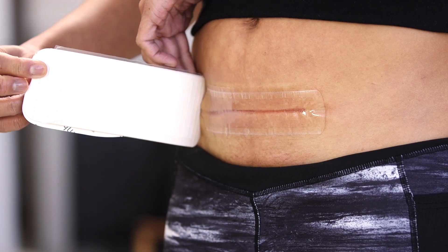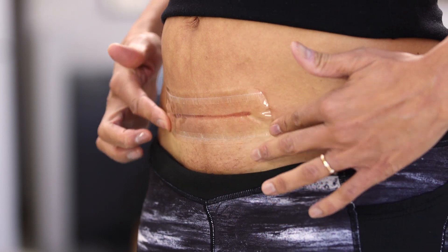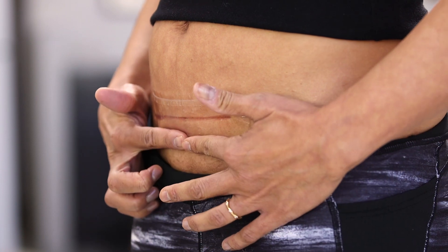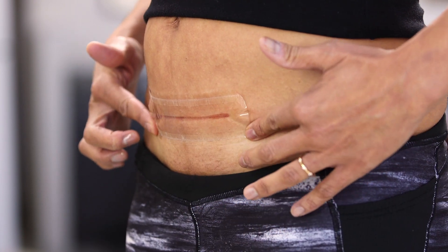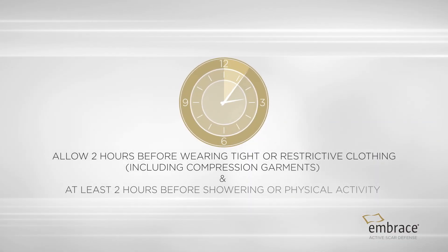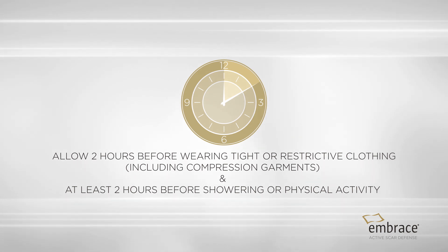If any air pockets occur, smooth them out and make sure the dressing is evenly adhered to your skin. Assure the edges are fully sealed around the dressing. Allow two hours before wearing tight or restrictive clothing and at least two hours before showering or physical activity.